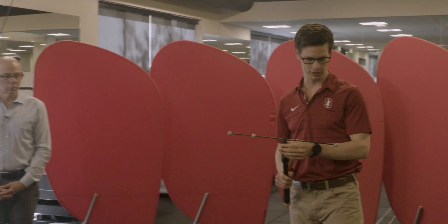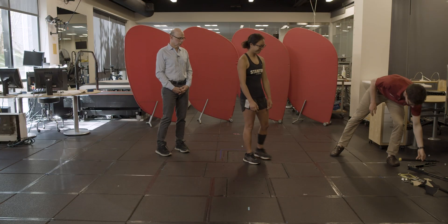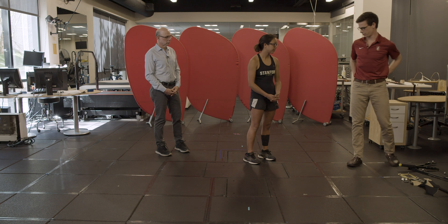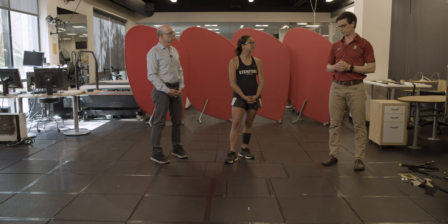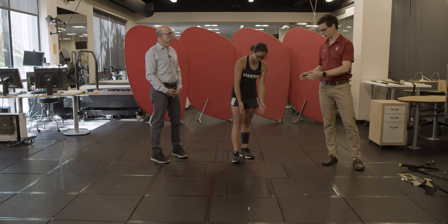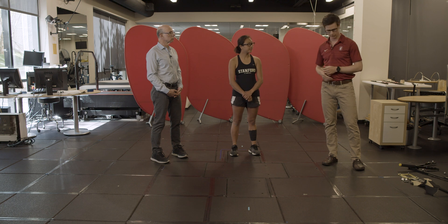Once we've calibrated the frame, the subject comes in — who is Hannah — and we start putting motion capture markers on her. Depending on the study, if we really cared about foot biomechanics we might put a ton of markers on her feet. But today we'll just characterize the motion of her right leg.